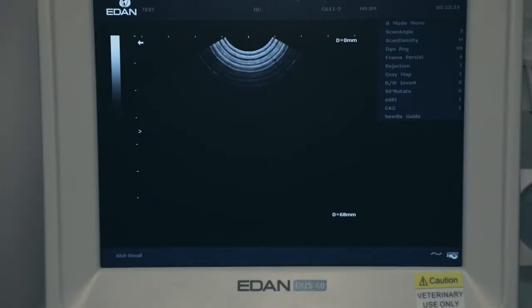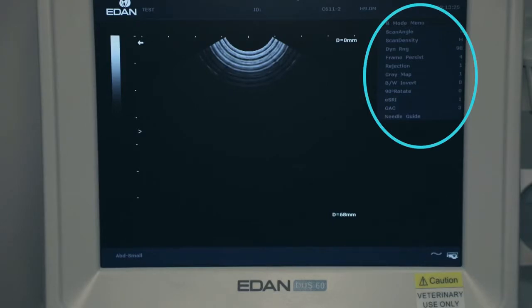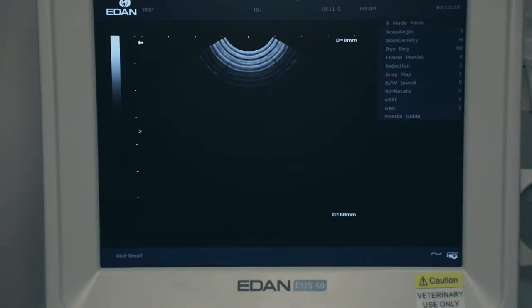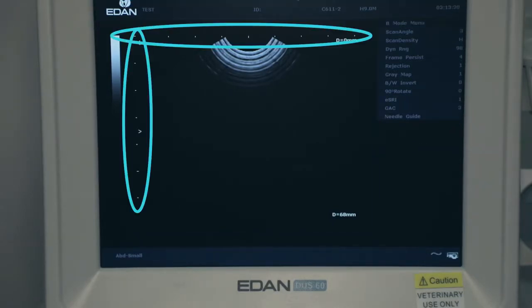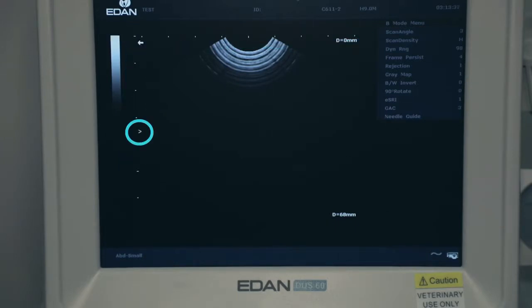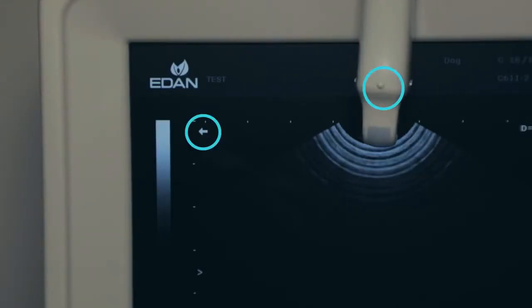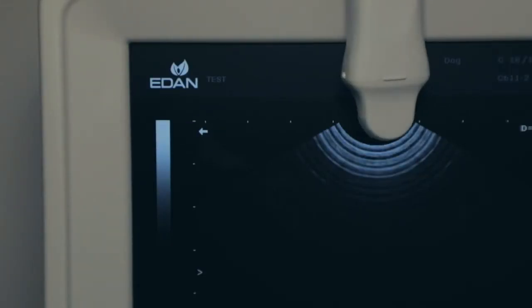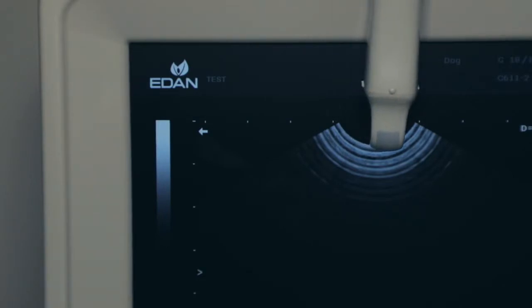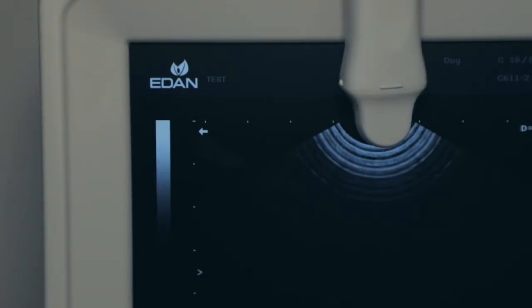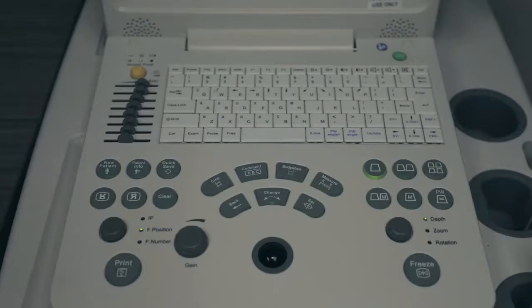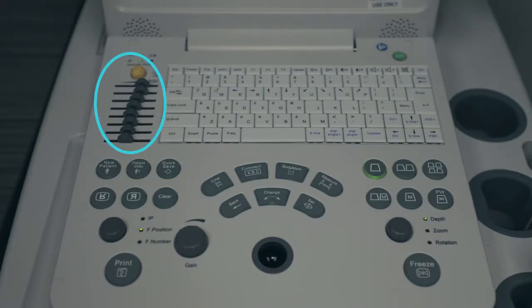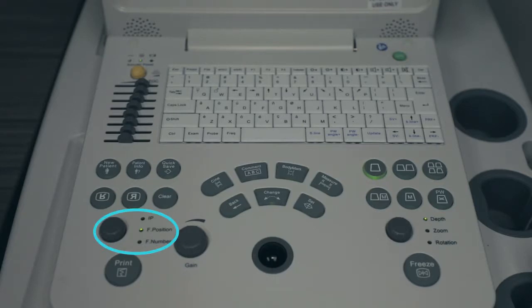Probe indicator corresponds to the position of the probe mark. Most important parameters are depth, gain, TGCs, frequency, and focal point.